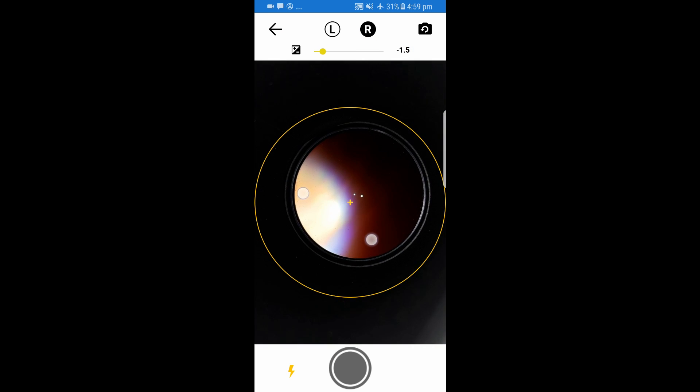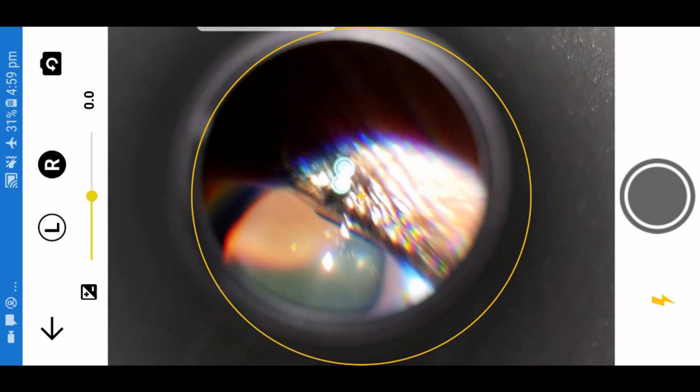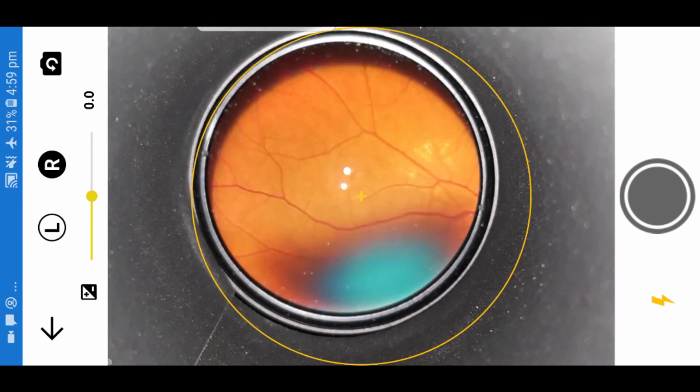This is a patient with a normal retina captured with the HopeScope device and the app. You can see the image is more or less centered, showing the right eye fundus image.